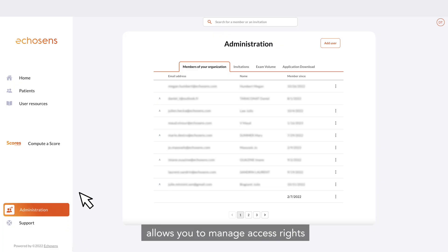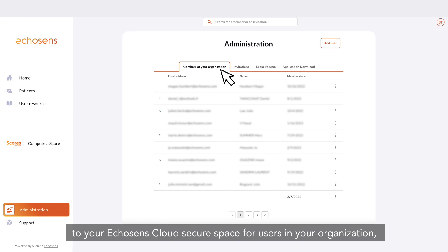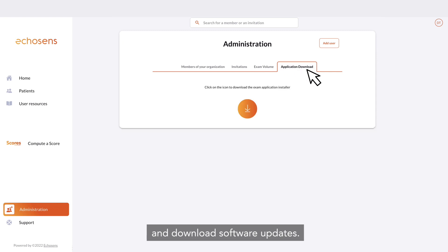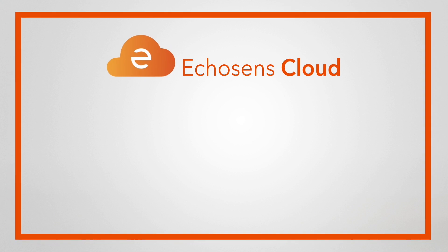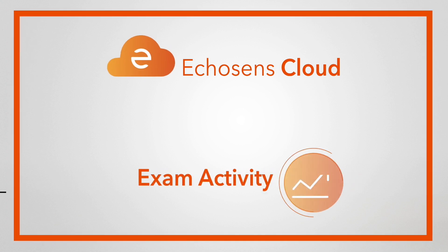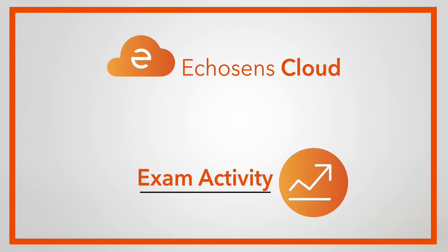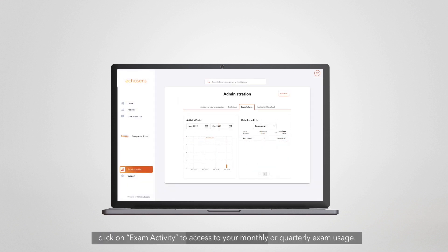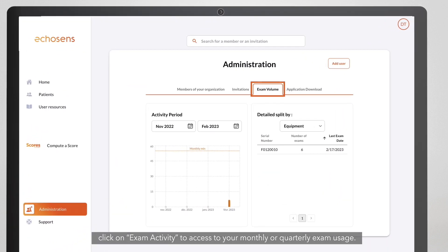The administration section allows you to manage access rights to your Echosense cloud secure space for users in your organization, see the number of exams performed, and download software updates. On Echosense cloud, click on exam activity to access your monthly or quarterly exam usage.